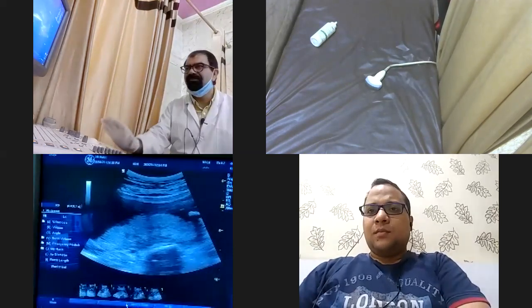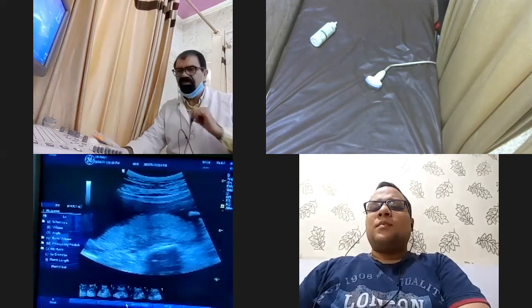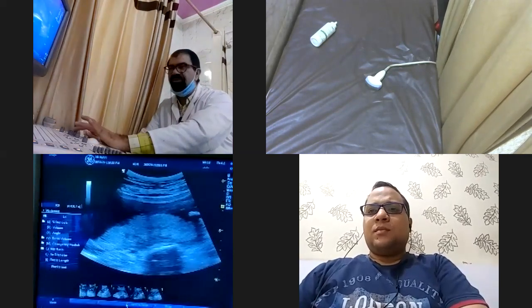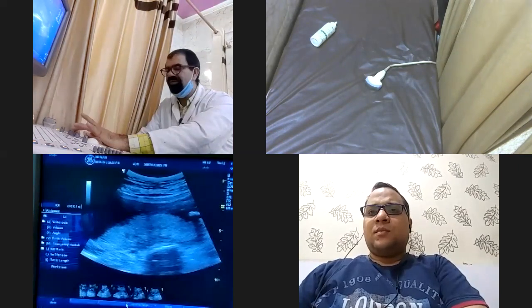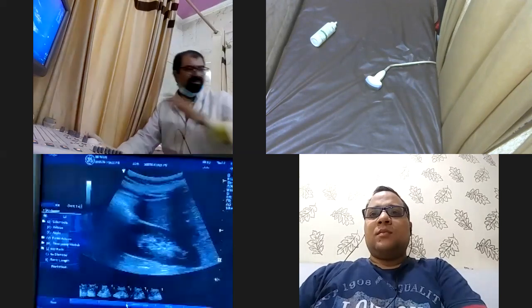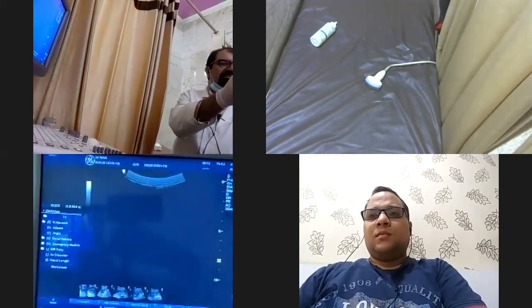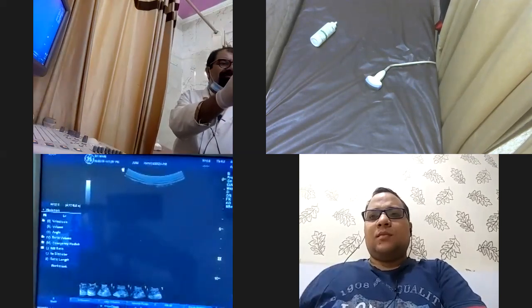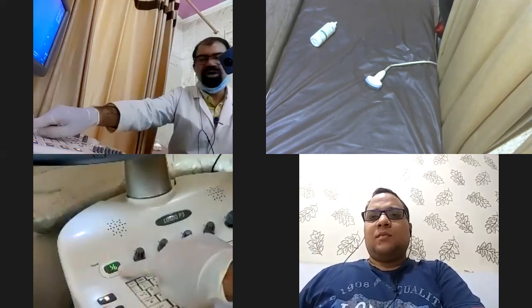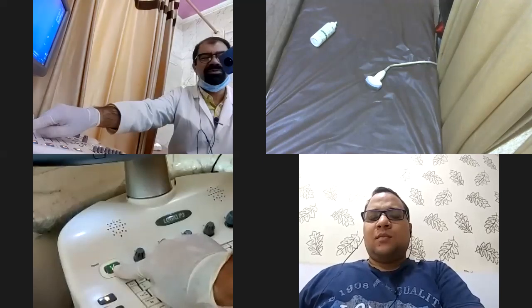right? Yes. Now, tell me something about the frequency. We have already discussed it with you. I will show you the frequency over here. Let me go to the machine. No, no, see, this is the machine over here. This is the on and off button, right? Yes, sir.